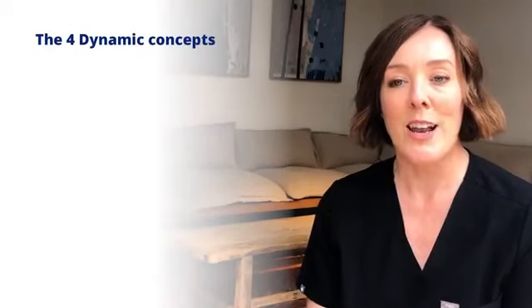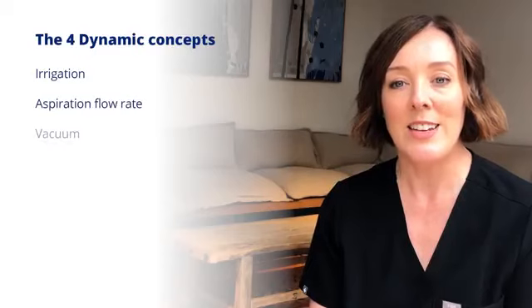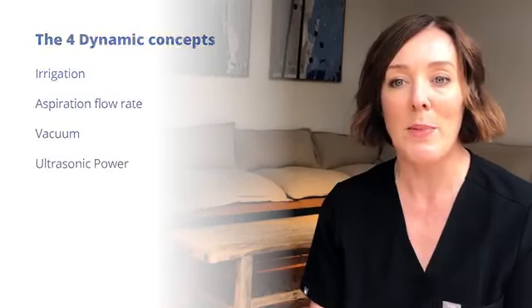Phacodynamics relates to four dynamic concepts: irrigation, aspiration flow rate, vacuum, and ultrasonic power. All of these factors combine to allow followability, which is the way material is attracted to the phaco tip, held at the tip, emulsified at the tip and cleared through the tubing. Properly orchestrated phacodynamics will result in good followability and improve the efficiency and safety of nuclear disassembly.